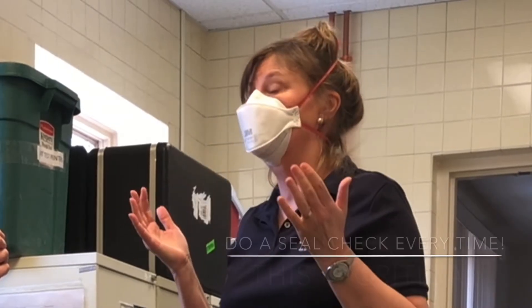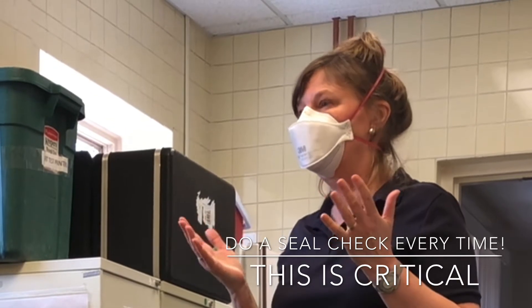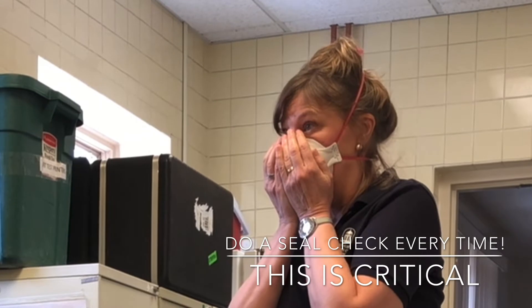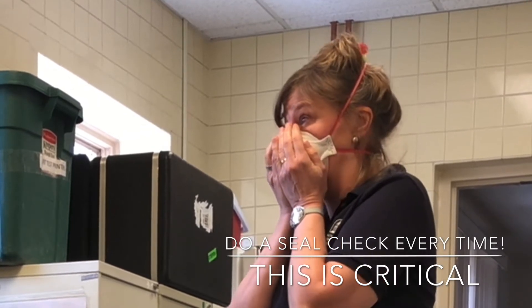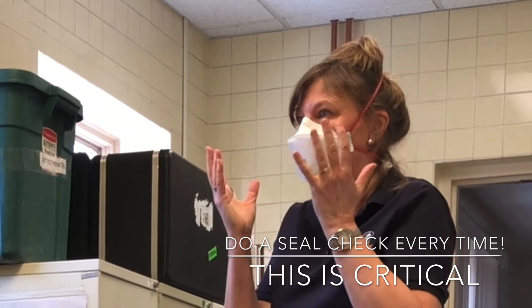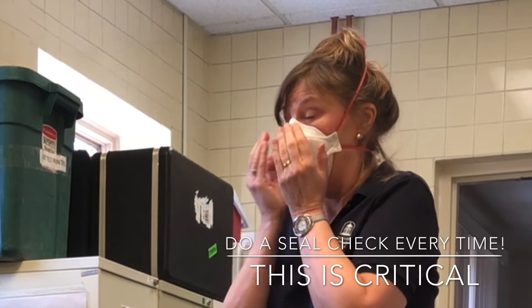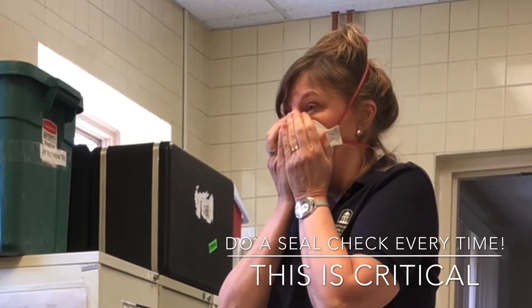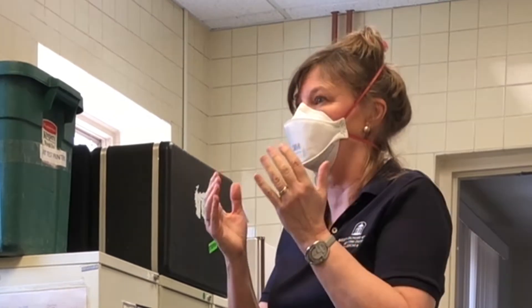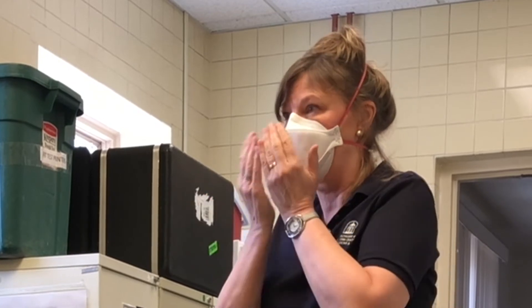The next thing you want to do is a seal check — a fit check — which is putting your hands over the surface without disturbing the positioning on your face. You're going to take a sharp breath in, and you're going to see: does it collapse towards your face a little bit? Can you feel it pulling in? It's a negative pressure we're going for here. And then the same thing blowing out — you can feel it kind of swelling out. Check any time you put on a respirator. You want to check that you've got a good seal by doing that fit check.